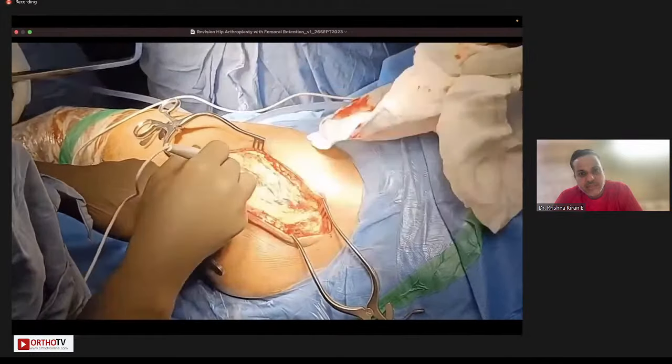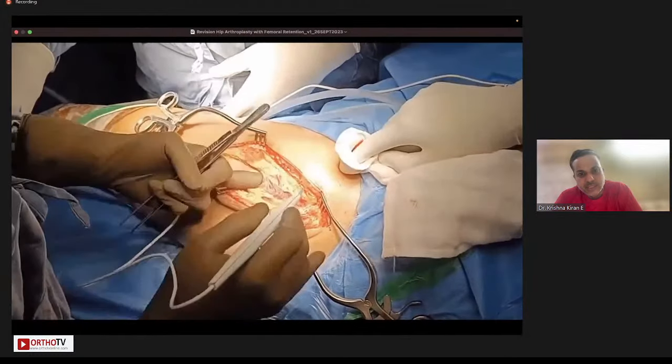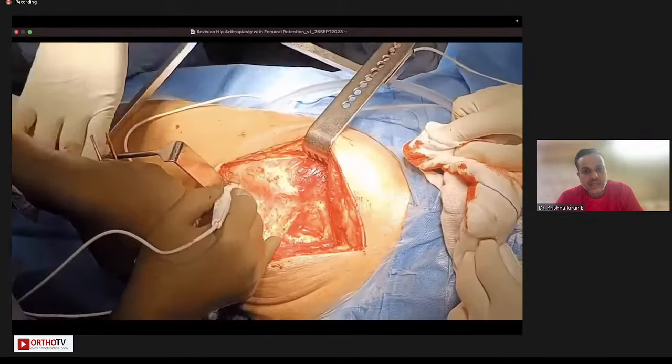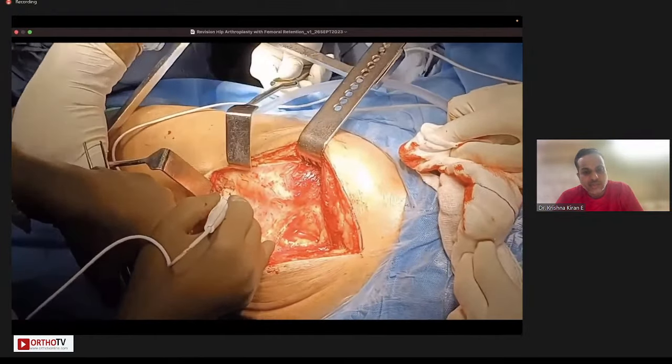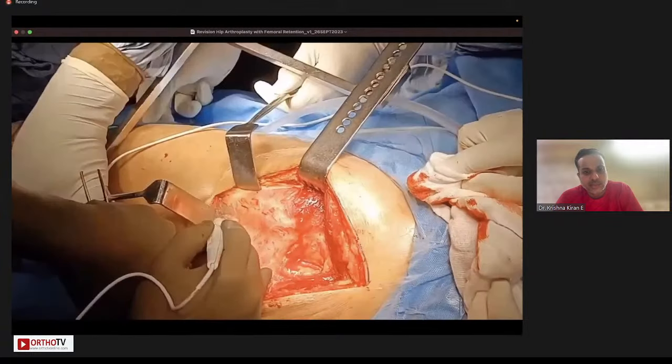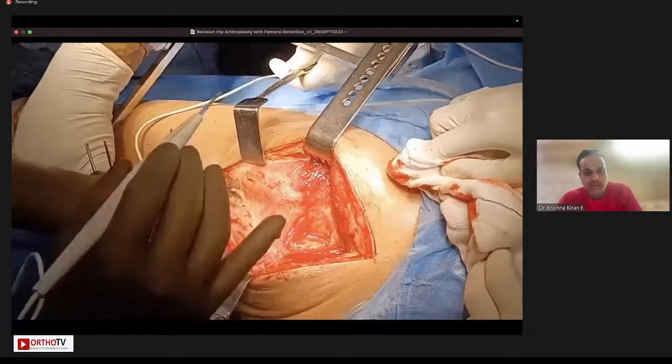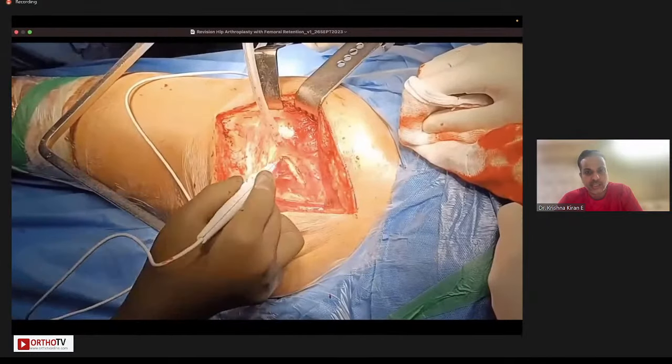Now, once you do the dissection through the subcutaneous tissue, you identify the fascia lata and cut the fascia lata from inferior to superior, identify the gluteus maximus and split the gluteus maximus in the line of fibers. Now, as I told you, the first key step for the acetabular exposure is to release the gluteus maximus insertion. This is quite broad, around 2 to 3 centimeters on the linea aspera.